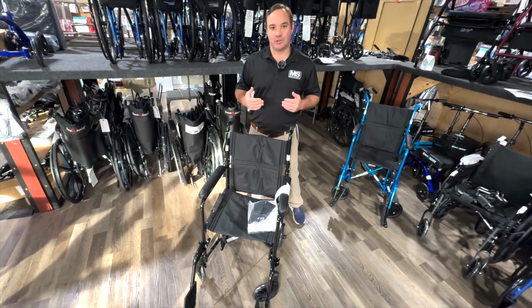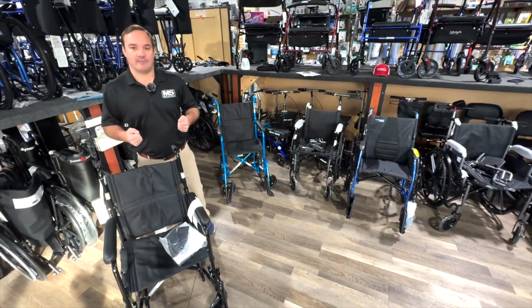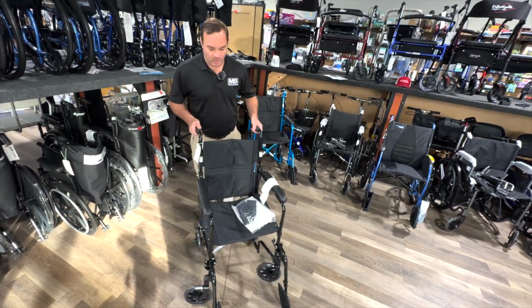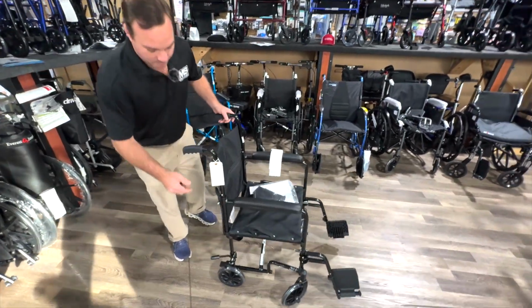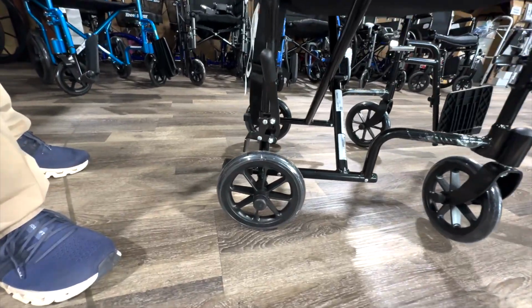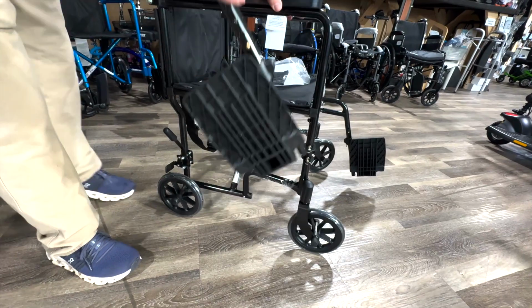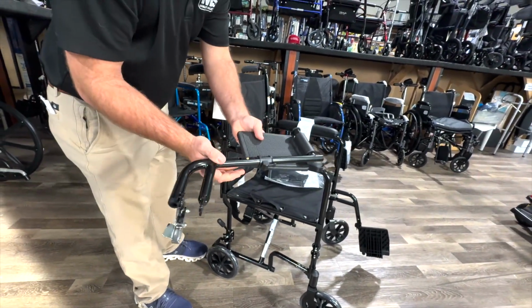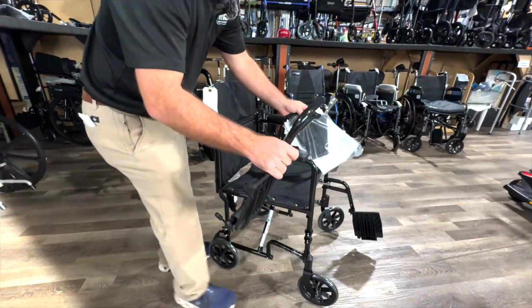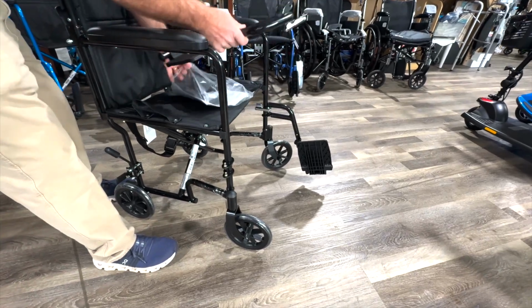Most manual wheelchairs you get through the insurance, or even if you buy them, that are really cheap, are going to be heavy. People have a hard time picking them up, and they're usually awkward to load into the car. What's nice about the transport chair is you do have the brakes at the back, usually has the full arms, and the leg rest. The leg rests swing out, they can be adjusted, they can be taken off. Most times transport chairs come with a calf pad. What this does will go from here to there to give your support behind your calf.